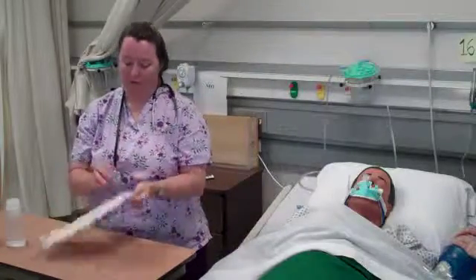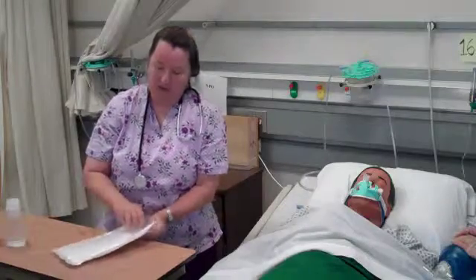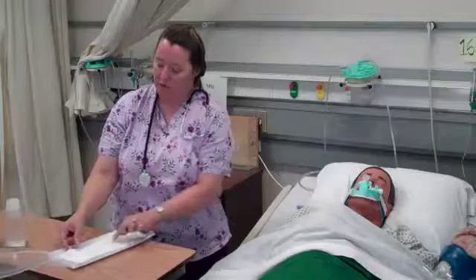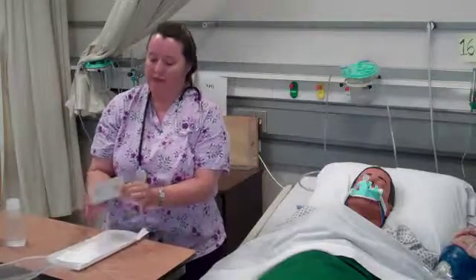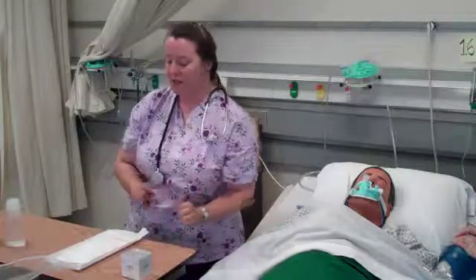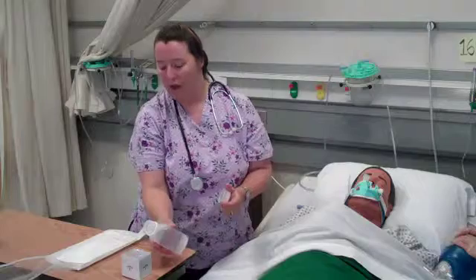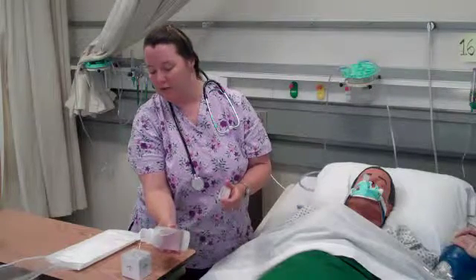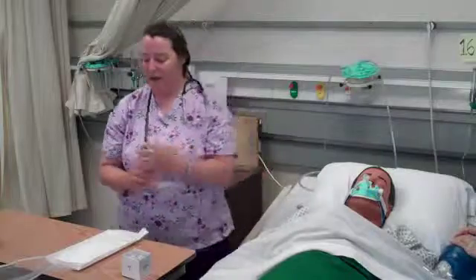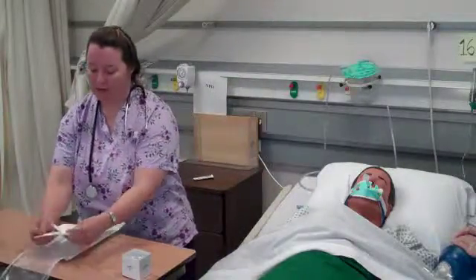And I'm going to get my equipment ready. Opening up any kind of packaging, making sure you open it up away from you. This kit comes with a little cup for the saline. I'm going to open it up. Sterile technique, I'm not going to touch the inside. I'm going to go ahead and take my saline and pour it into the cup there, not touching the container. Get my saline ready. And now I can go ahead and open up my catheter kit here.